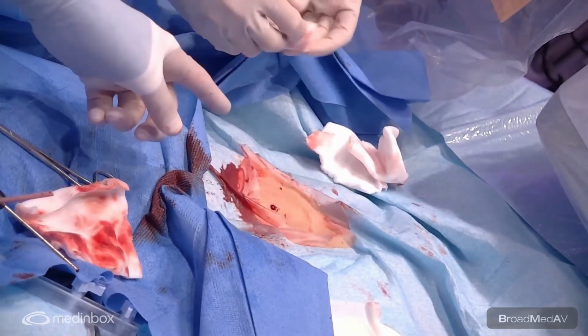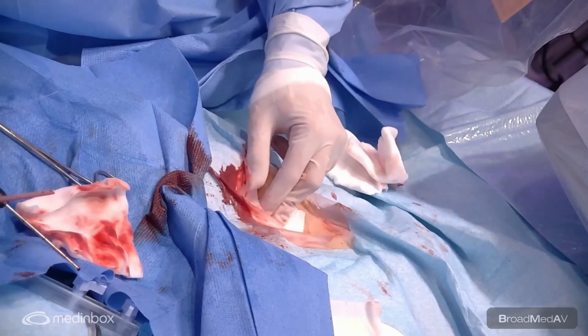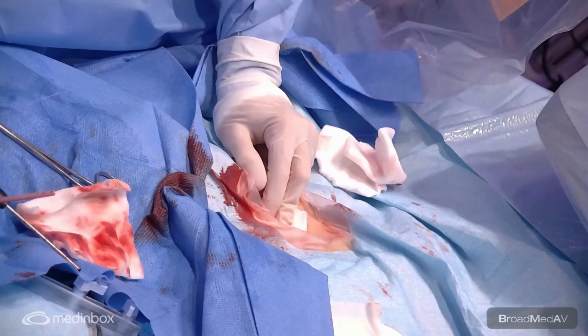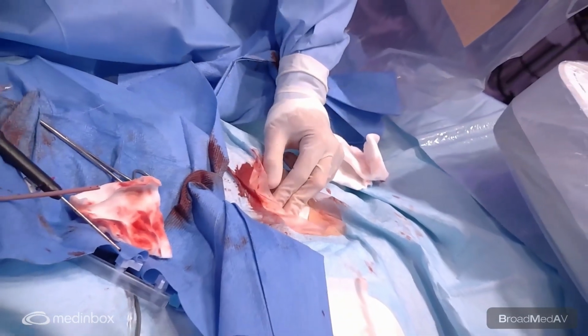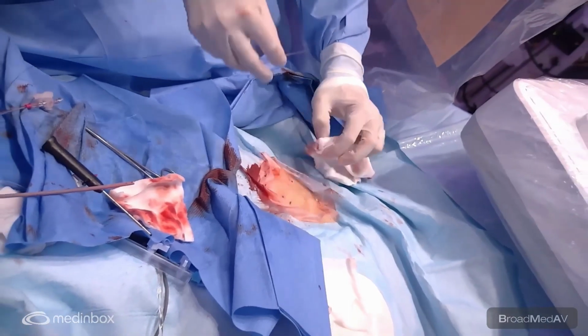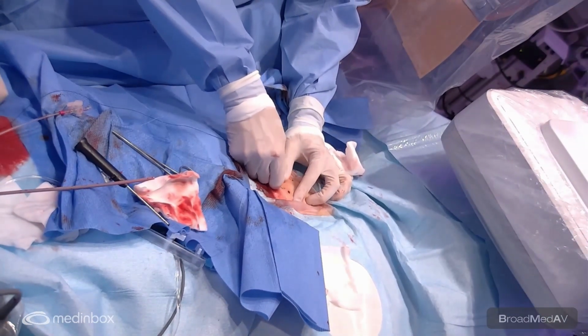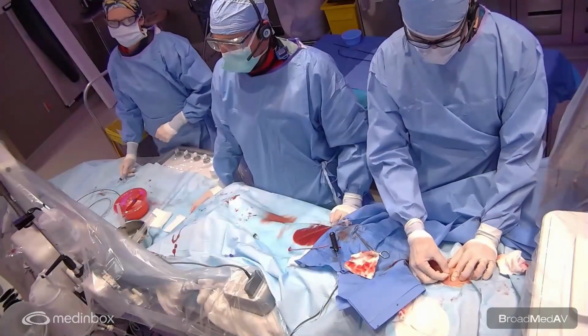See, the one access is not bleeding at all. The other one has a small oozing coming more from the subcutaneous tissue. But take xylo with EP, please, and a small suture. And I think that's going to be it. Unless we have other questions, I think it's going to be the end of this case.